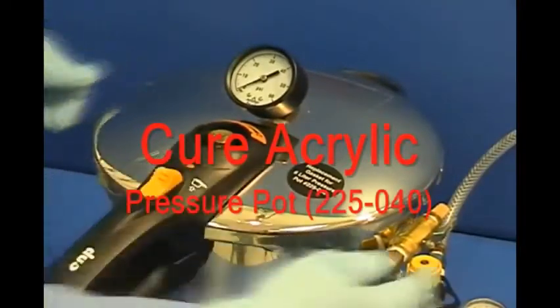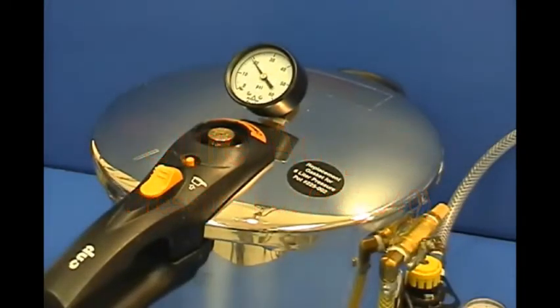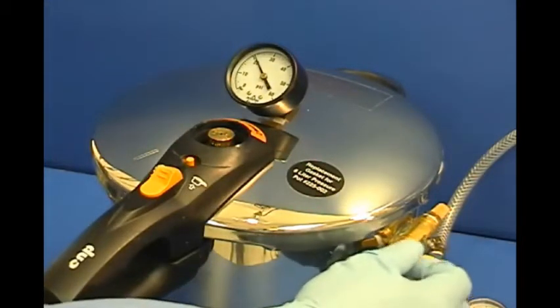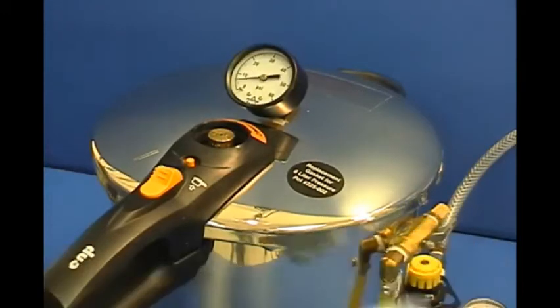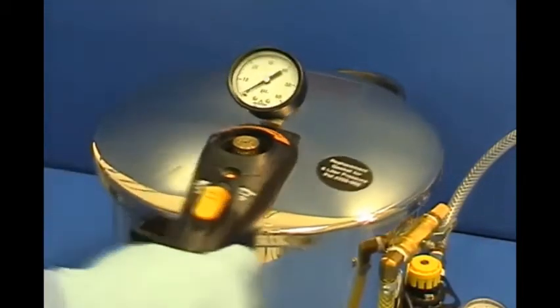Place the model and acrylic resin into a humid pressure pot for 15 minutes. Pressure should be adjusted to approximately 20 psi. At the end of the curing cycle of the resin, evacuate the pressure from the pot. Remove model and cured acrylic.